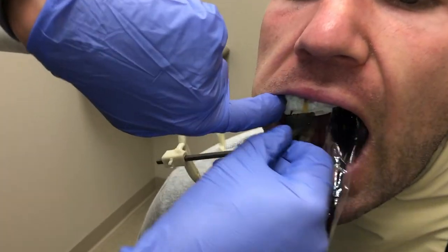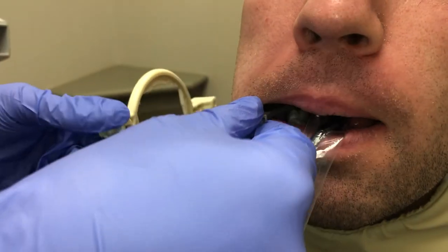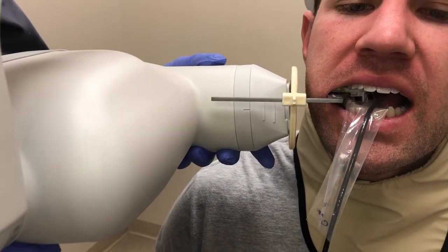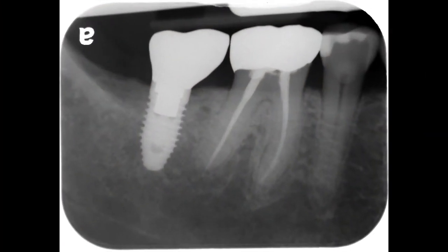To capture a mandibular molar periapical radiograph, move the sensor posterior. Place the position indicating device parallel to the rod as indicated in the premolar radiograph. A good mandibular molar periapical radiograph will capture the entire tooth and root length of the most distally erupted tooth, mandibular molars, and 2 mm of bone apical to the apex of the root.